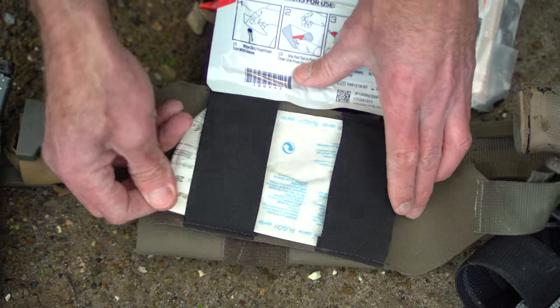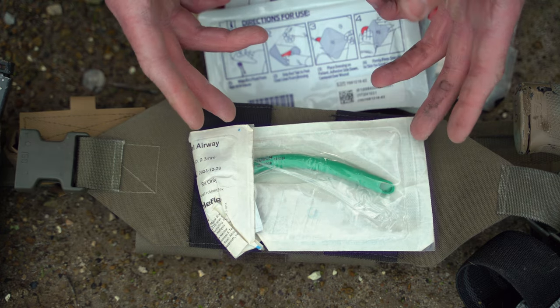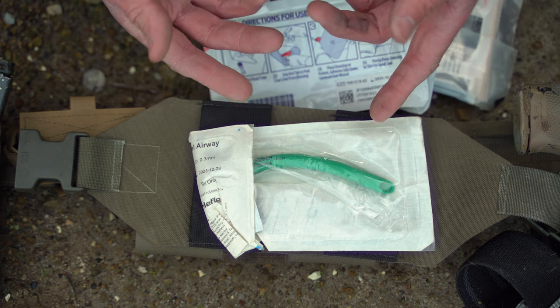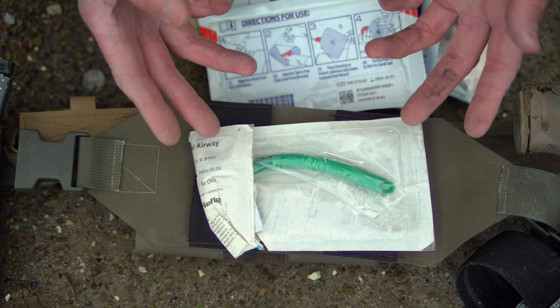Last but not least we have an airway. This is really important in certain situations, especially with explosions, burn victims, and stuff like that. If you don't know how to use one, it's in there — but don't use it if you don't know how or when to use it.